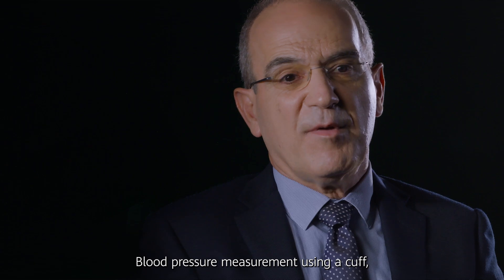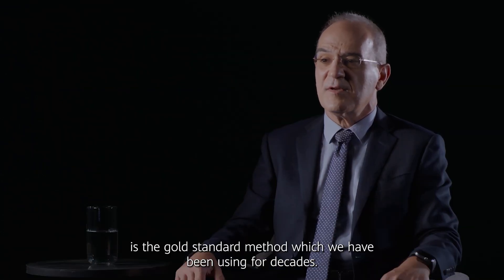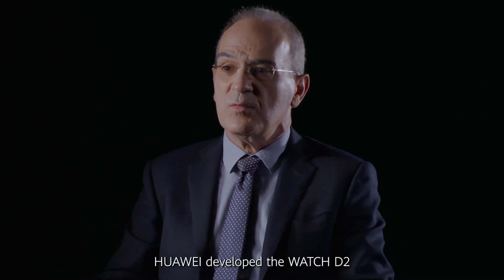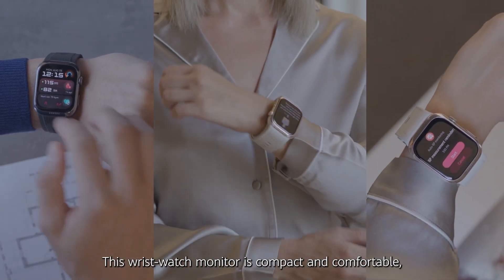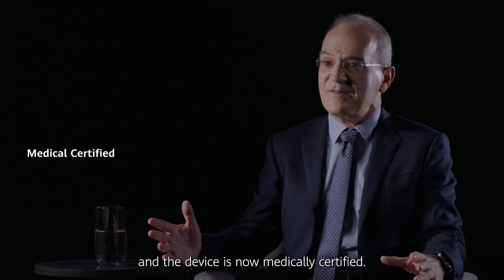Blood pressure measurement using a cuff is the gold standard method which we have been using for decades. Huawei developed the Watch D2 with a thin cuff embedded into the wrist strap. This wristwatch monitor is compact and comfortable, and the device is now medically certified.